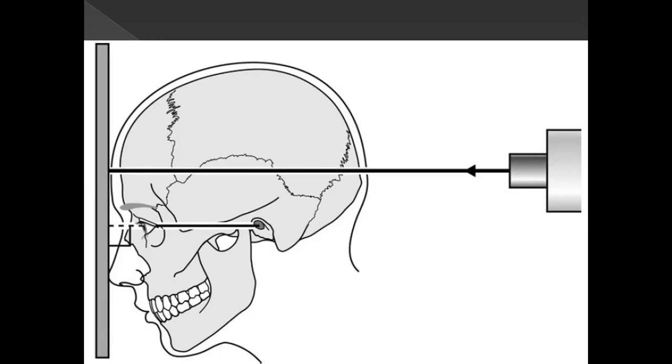All of the dentistry projections that you will come across, all of them are PA projections. And you will find very little indication for AP views. One reason I already told you in the previous session on midface X-rays: when you have an AP view, that means that the X-ray tube will be in front of the patient and the film will be at the back. So your eyes will be getting a lot of the radiation dose. All right. So we want to minimize the radiation dose to the eyes. That is the first reason.